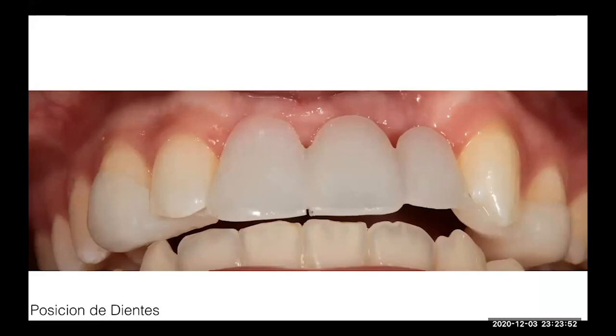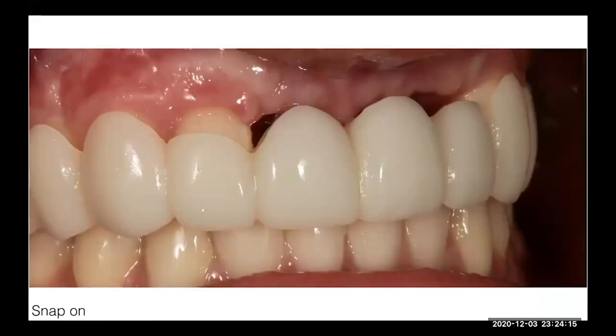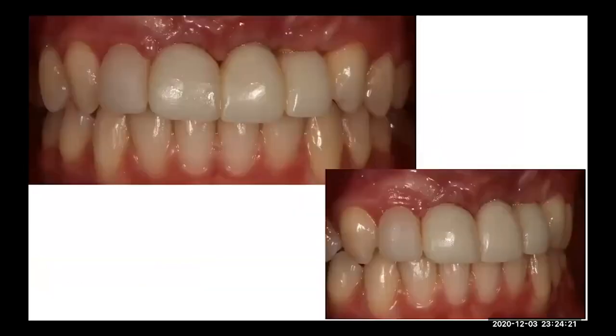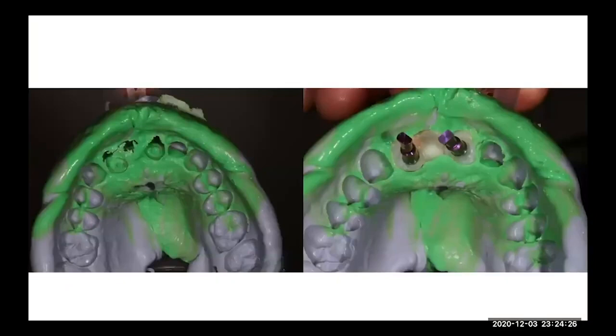The surgeon sent me the case and told me, Rafael, I need to place ideally 3 teeth in the space that I have. So from there, he started his surgery, and then the implants healed. The prosthodontist put some snap-on restoration until the implants healed properly. So when the patient was ready to take the impression, we did an indirect impression to get an exact copy of the temporaries to mimic all the restoration to that.